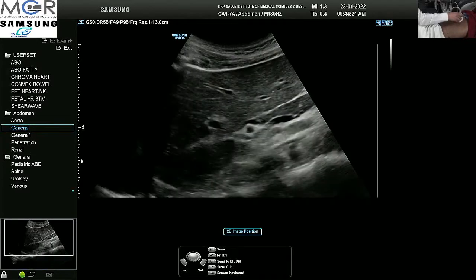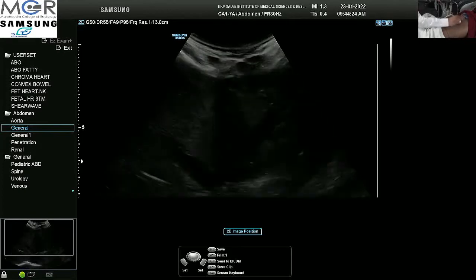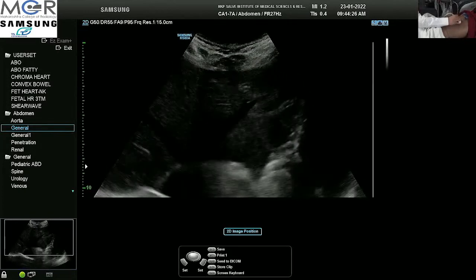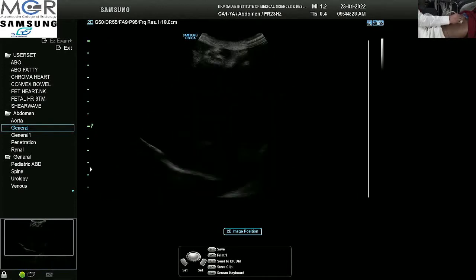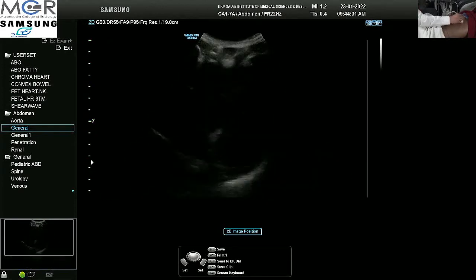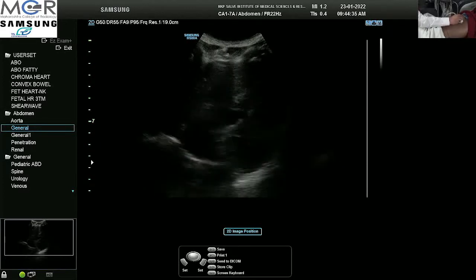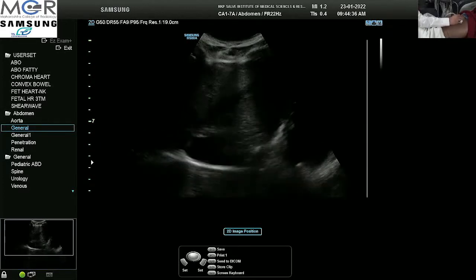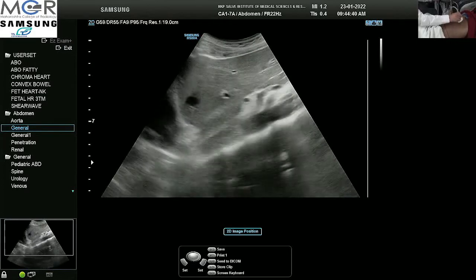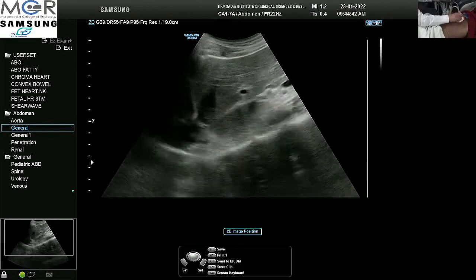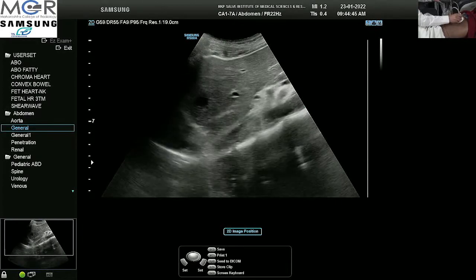Another thing — if I make the probe transverse and give it a slight cranial angulation, I can see the heart and any pericardial fluid. So by keeping the probe here, I can look at these three things in addition to the gastroesophageal junction that we can see in this view.